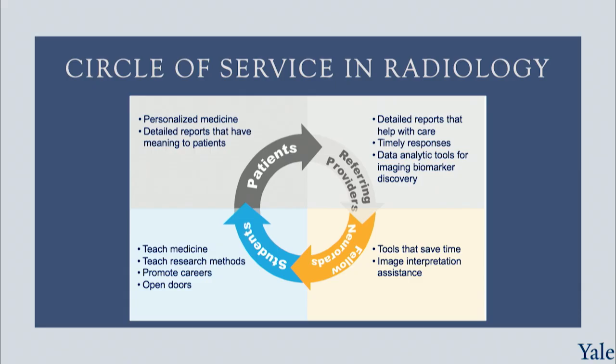In addition, we're providing service to our referring providers where we generate detailed reports that actually help with care. They don't just form a simple diagnosis, they can actually track how a tumor can grow over time, and that will provide the oncologist or neuro-oncologist or endocrinologist how they should be treating the patient and when they should initiate new therapy.